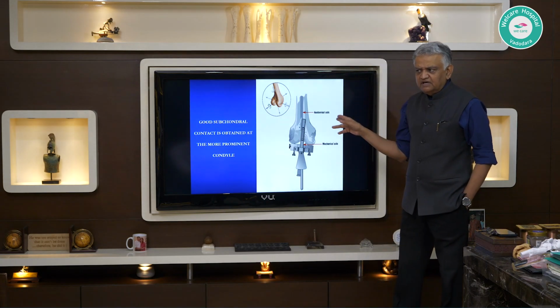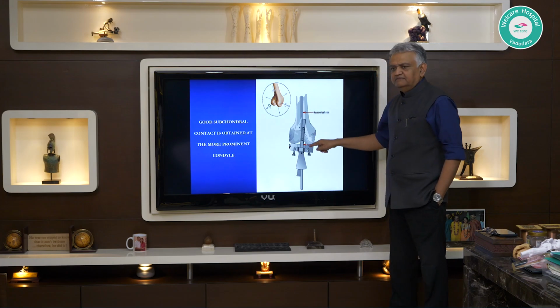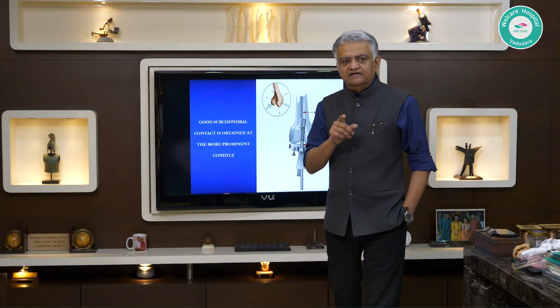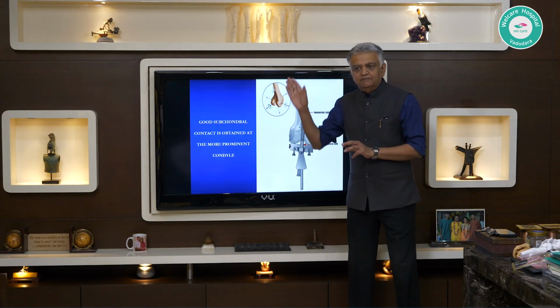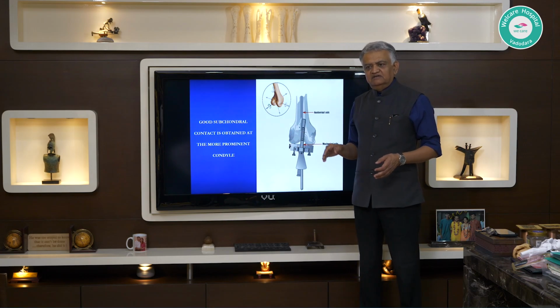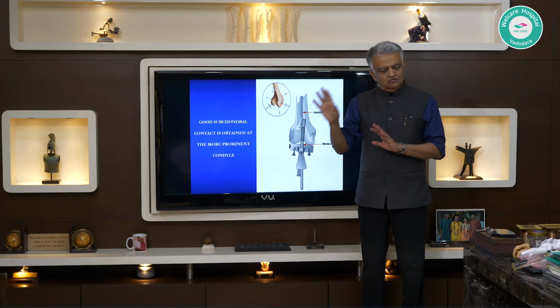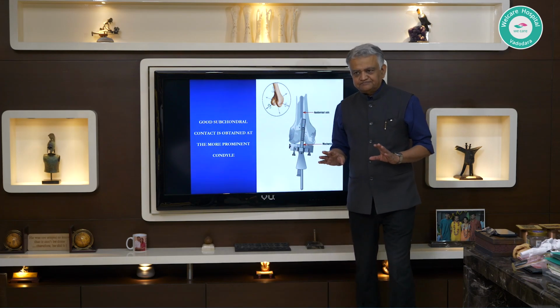So again, a quick understanding now that you have focused. What this rod insertion represents is you establishing the anatomical axis and then doing your cuts by back calculating for the mechanical axis. And the fundamental difference between this and navigation, robotics is just one more machine cut just to do that. Robotics is 90% navigation, 10% a little bit extra.